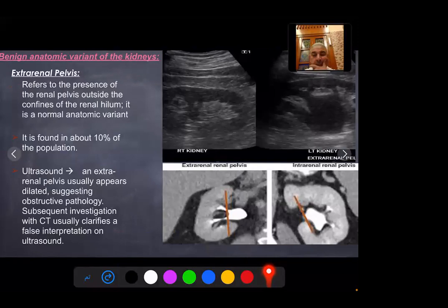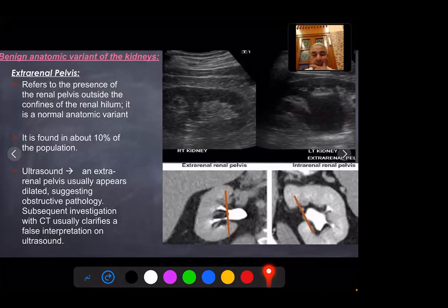Benign anatomical variants also include extrarenal pelvis, which refers to the presence of the renal pelvis outside the confines of the renal hilum. It is a normal anatomical variant found in approximately 10% of the population. Ultrasound may show this as an apparently dilated structure suggesting obstructive pathology, but subsequent CT examination can clarify and confirm it as extrarenal pelvis.